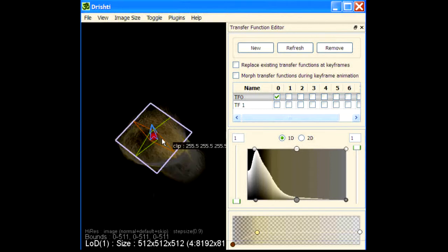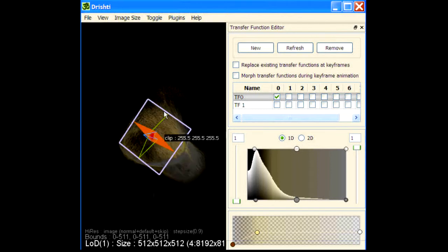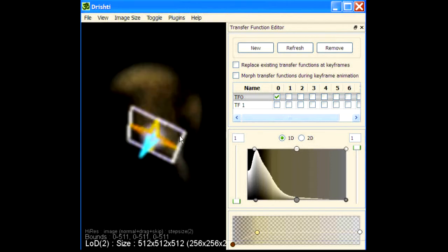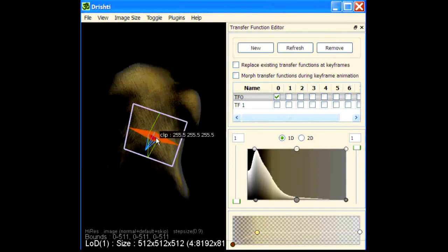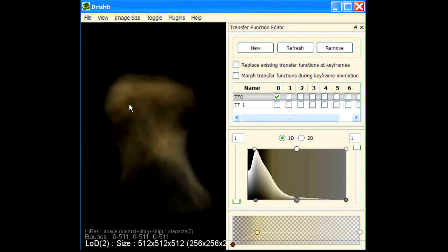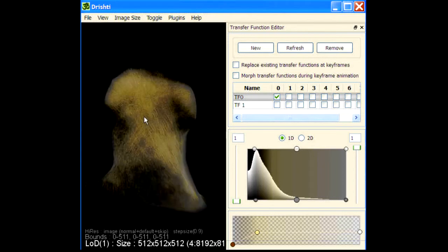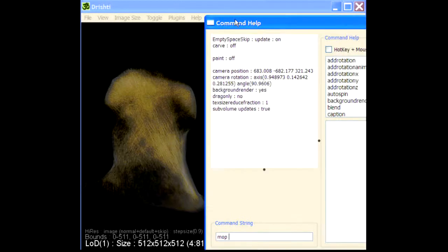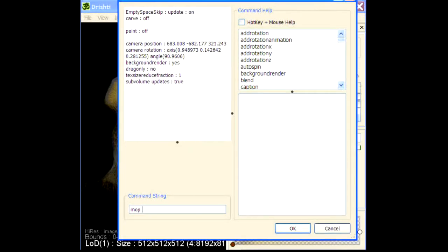It has applied the city block transform and it has applied it as an opacity to the volume. Now we will copy this opacity which is in channel 1 in the mass buffer to channel 2 in the mass buffer.